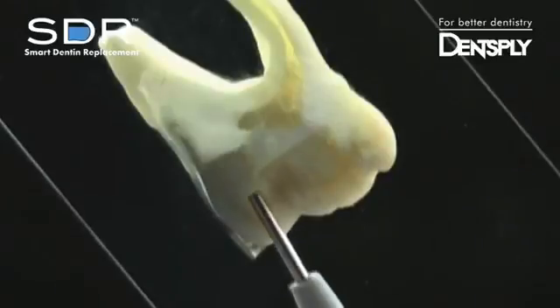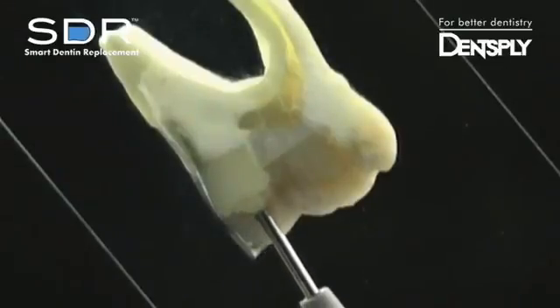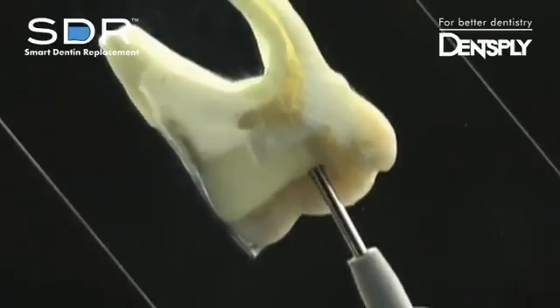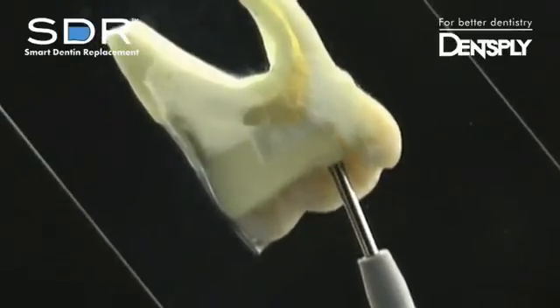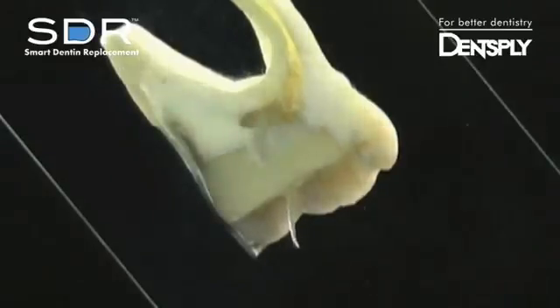Begin dispensing at the deepest part of the proximal box and watch as SDR self-levels and adapts to the corners of the prep. After dispensing up to 4 millimeters, SDR remains where placed and does not slump or flow out of the cavity preparation, making it ideal for use in maxillary posterior restorations.